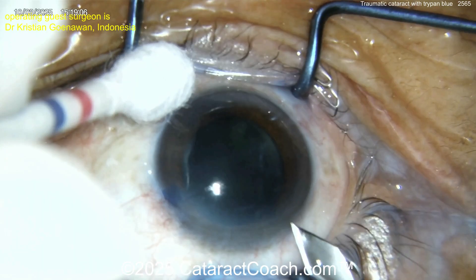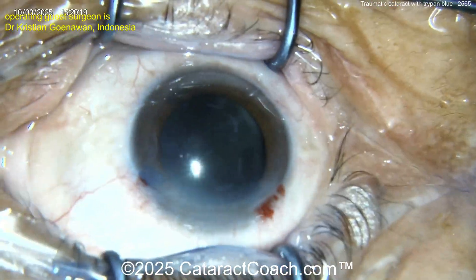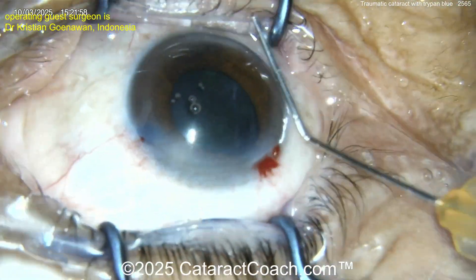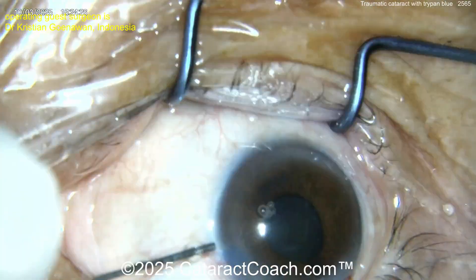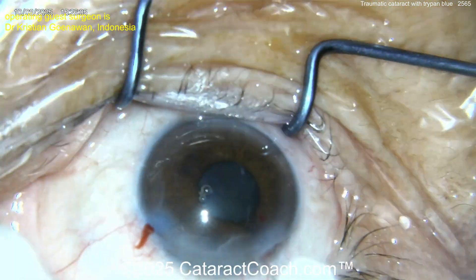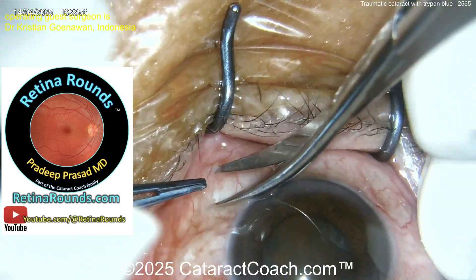There's already vitreous present in the anterior chamber of the eye. You can make a main incision here and try to cut some of that prolapsed vitreous — that's one way of doing it. You may prefer next time to put in trypan blue second, but first put in triamcinolone so you can see the vitreous prolapse and address that, and not inject so much trypan blue dye. Here the surgeon is going to close up this case and come back a month later — and the blue dye will resolve.